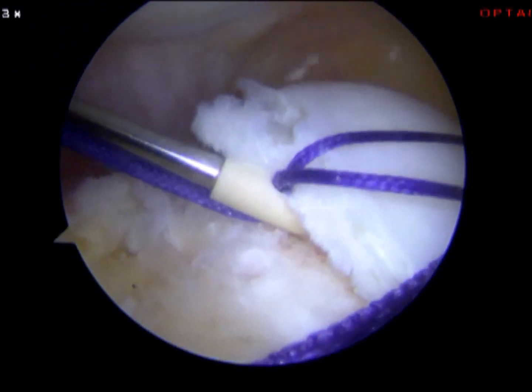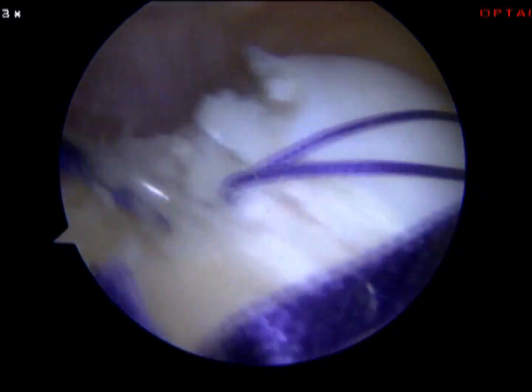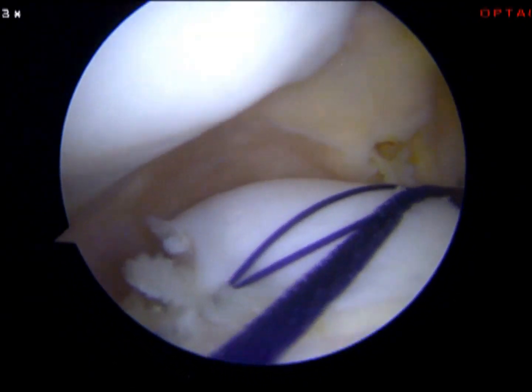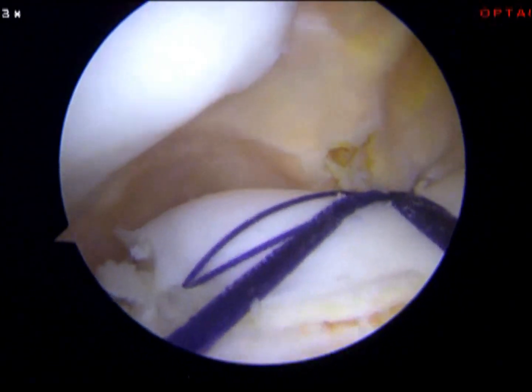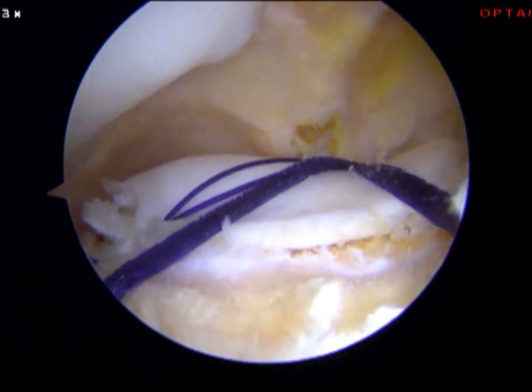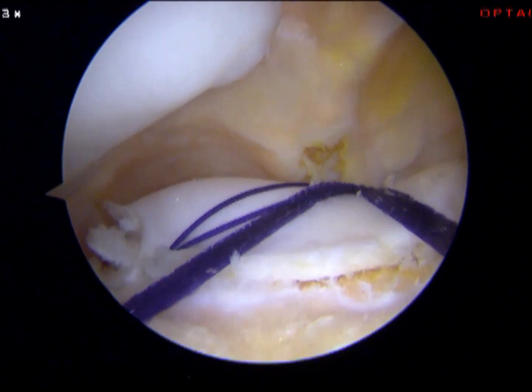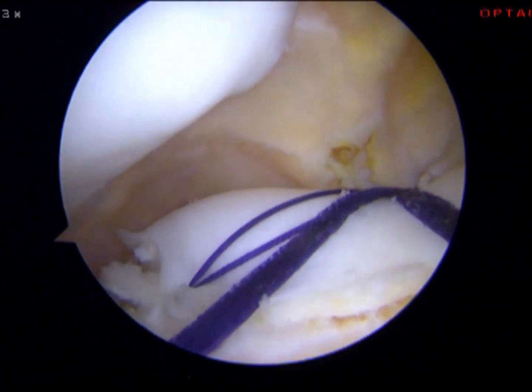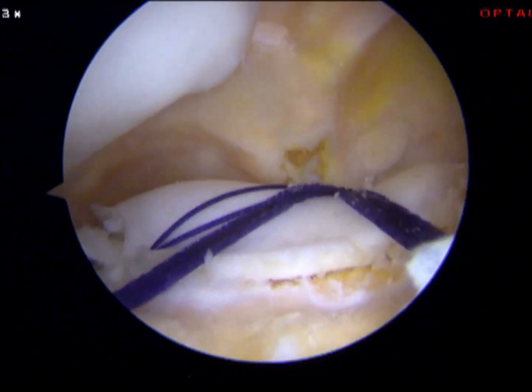All together I use three to four anchors with tapes and sutures to fix the cartilage flake. In this situation I have three anchors above the cartilage flake. And here it's finished. Thank you.